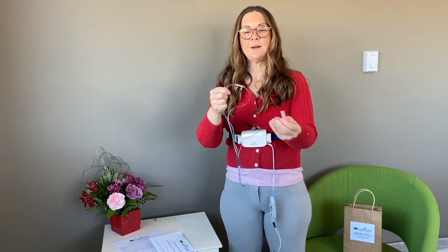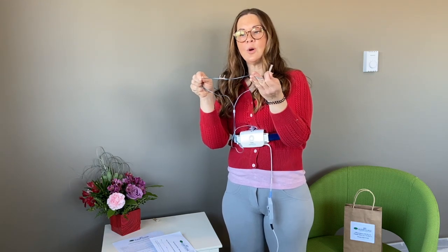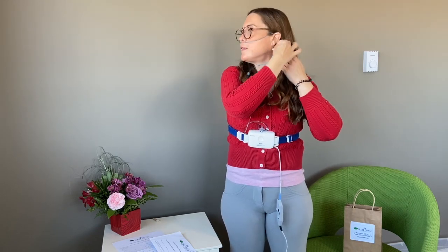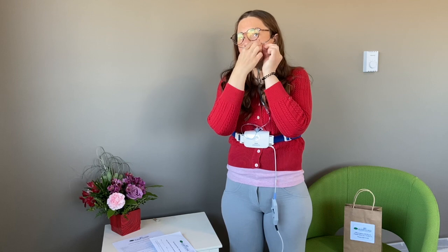The next thing you do is take the nasal cannula. You'll see it's got a little bit of a curve to it — these curve into your nostrils and they tell us when you're breathing in and out and when you're snoring. Tuck those into your nostrils. The cord goes around the back of your ears, and there's a little slider that slides it snugly up under your chin. We've included some tape so you can tape it nice and high on your cheeks — use two pieces of tape for each side.